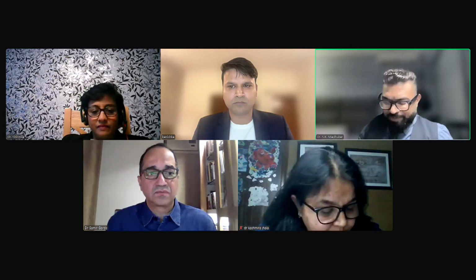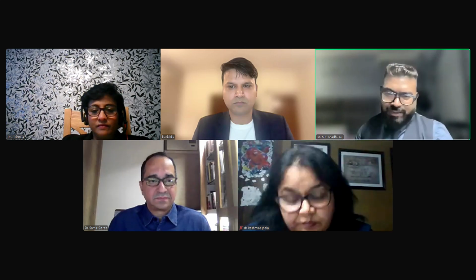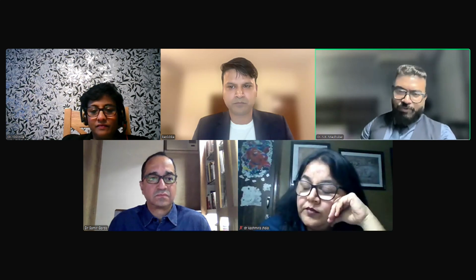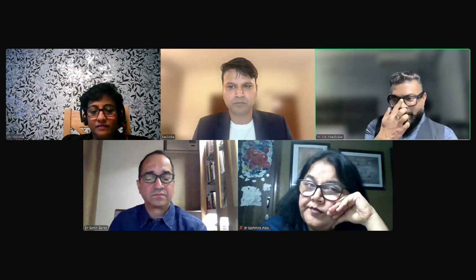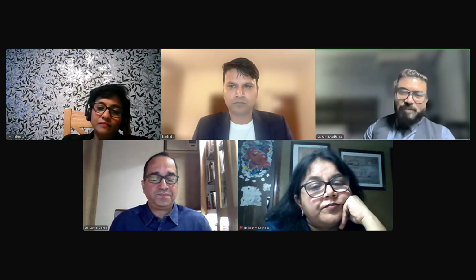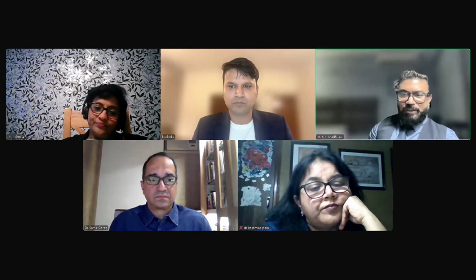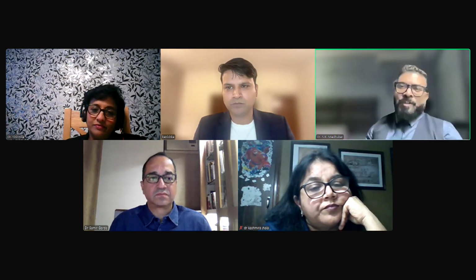Yeah, thank you, Dr. Samir. What we could get from you is, number one, if the patient has symptoms suggestive of obstructive sleep apnea, like sleep fragmentation, daytime sleepiness, that makes one case where we would like to do PSG. The second point is when the patient is on NIV and you want to monitor the success of NIV in terms of the patient's hypoventilation, whether his hypoventilation has improved on NIV or not. That is one part where we would incorporate PSG.